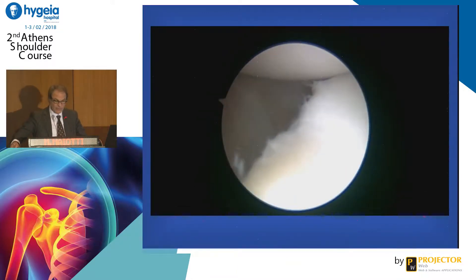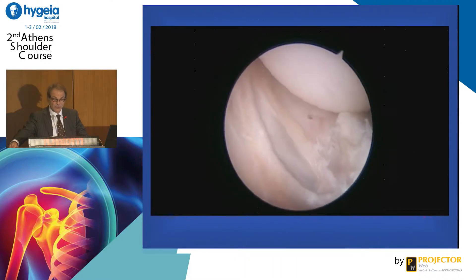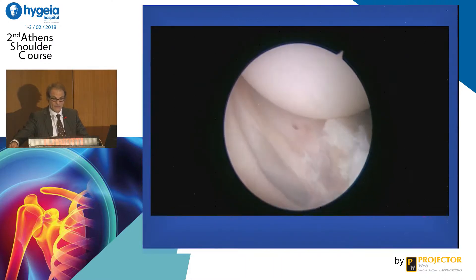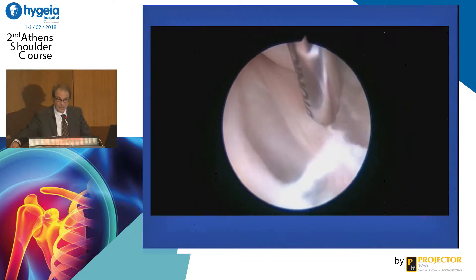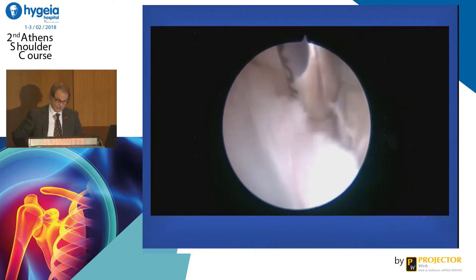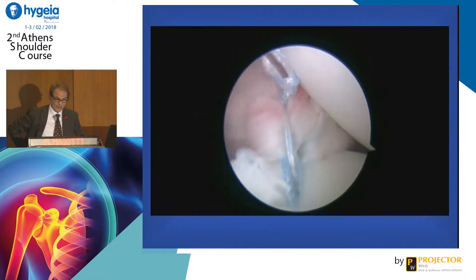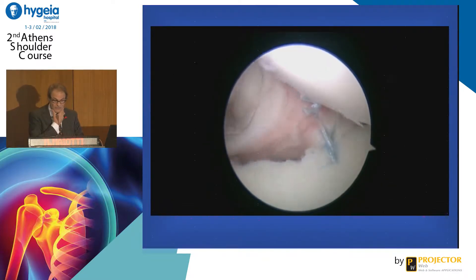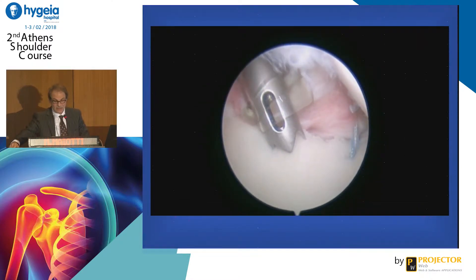This is a brief video of the technique. You can see no capsule, no labrum, bad capsule. The humeral head is completely dislocated. First step, you have to prepare the glenoid neck very well as you do a capsuloplasty. Then you do the inferior capsulorrhaphy, and then you proceed to do the tenodesis.